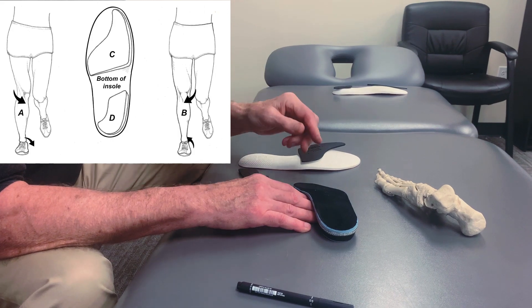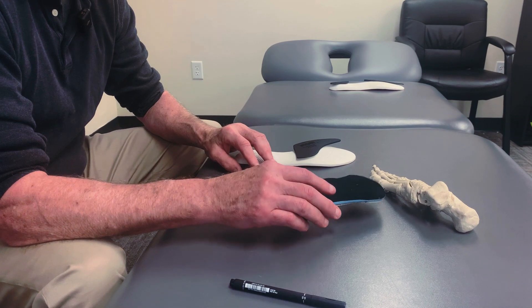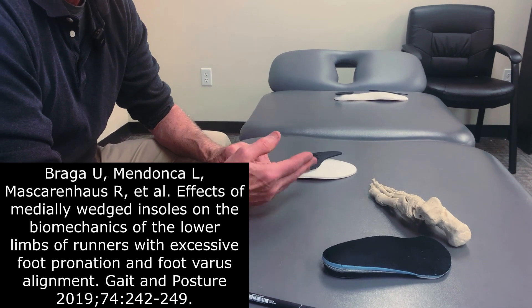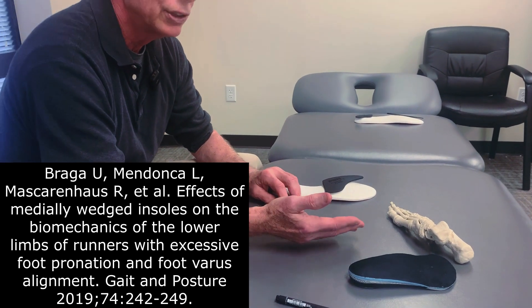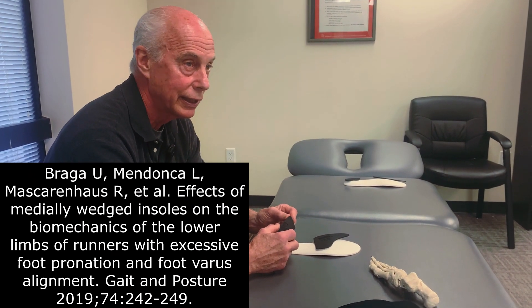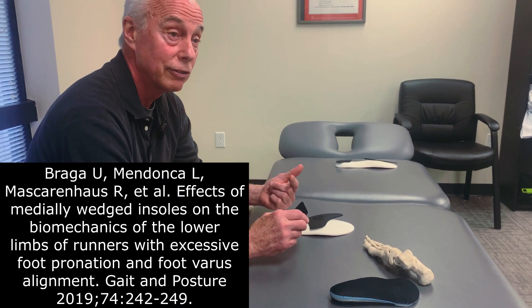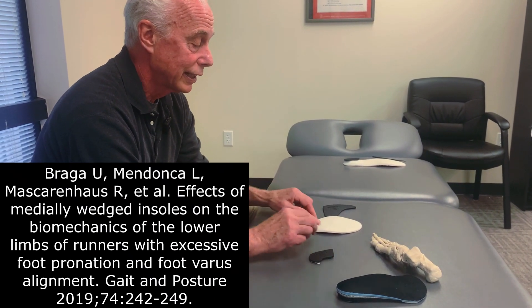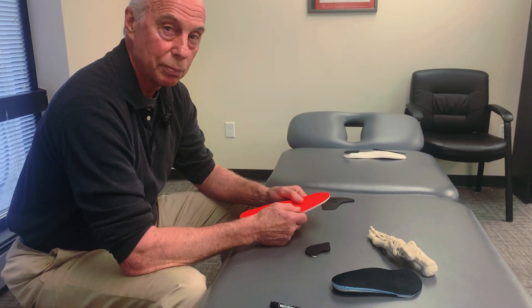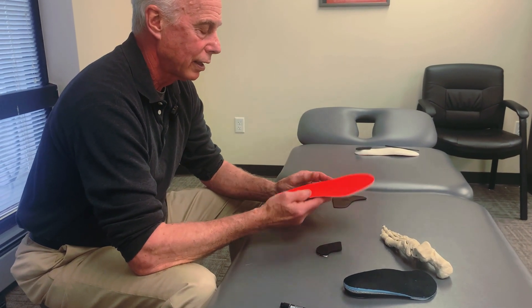After I read that research, I said rather than support the arch, I'm just going to use the wedges. A few years ago a paper came out where they just looked at the effect of the shell versus the wedge, and the wedges do the same thing — they alter motion, decelerate velocity, and decrease the velocity of internal rotation of the knee, which is predictive of patellar tendinopathy. Orthotics cost $400, and these are really simple and easy to use. They're also extremely lightweight, which is important for runners.